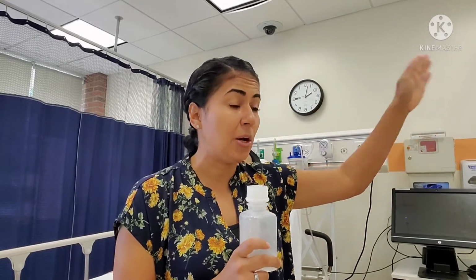Sometimes what could happen, and I've seen this more commonly, is that somebody comes by and knocks over the chest tube, and the drainage system can break, okay? If it breaks, then at the bedside, I should have had my sterile water, and what I'm going to do is I'm going to go call Becky, go get me another drainage system, and in the process, I put my chest tube into my sterile water.